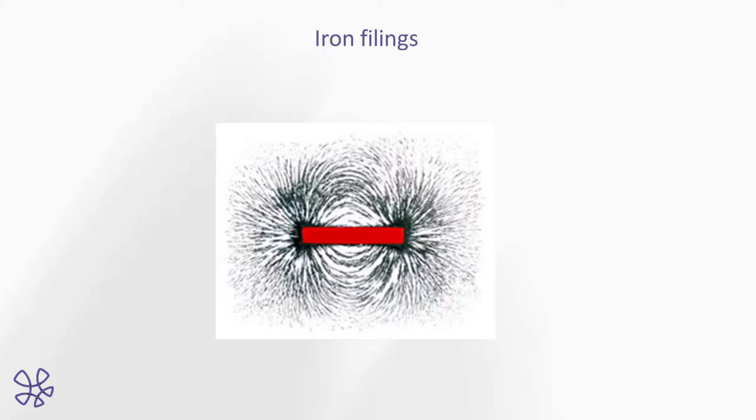So at the rock concert, you've got the big stacks of speakers, and they all have about a 3T magnet in them to make the cone come in and out. And that's what we use now for MR, is 3T MRI. So if anybody offers you a 1.5 for a prostate, they're not in the game, okay? You want 3T. Because prostate cancer is hard to image, so we need all the power of the machine we can garner.